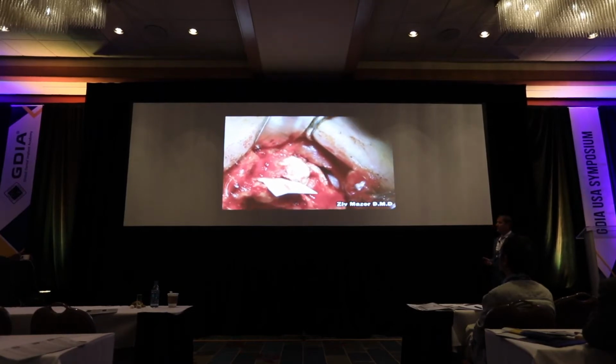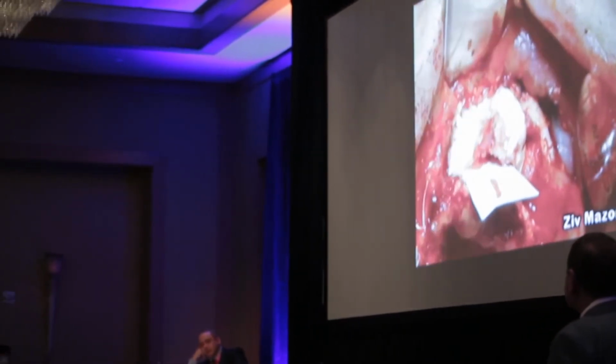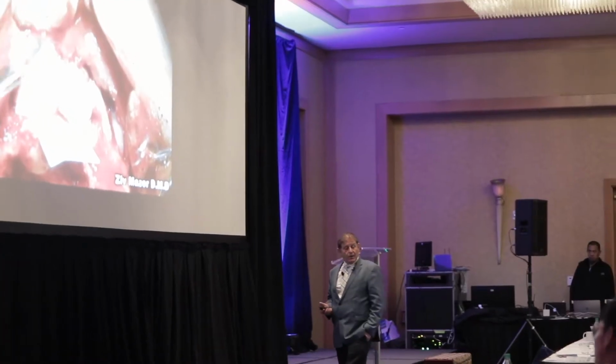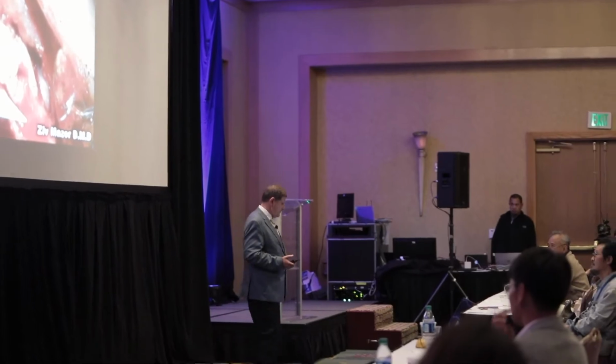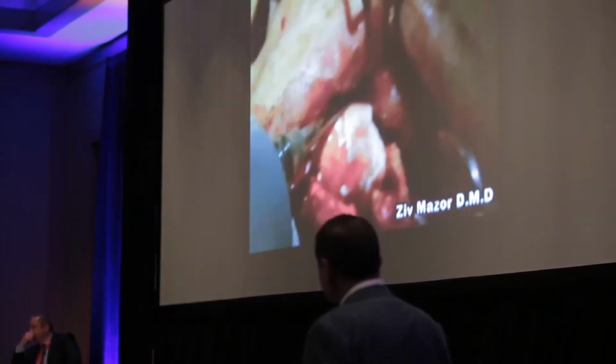Now, if we work with granules, the first thing that we need to do is to take a barrier membrane. We need to mix our granules with something in order to improve their handling. And I think everybody can see the difference. A video is better than 1,000 words. Now the question is, what will be the results? And definitely we shortened the video because it would probably take a few more minutes. Now, of course, we need to close it, primary closure, tension-free, which is very important when we work with membranes.